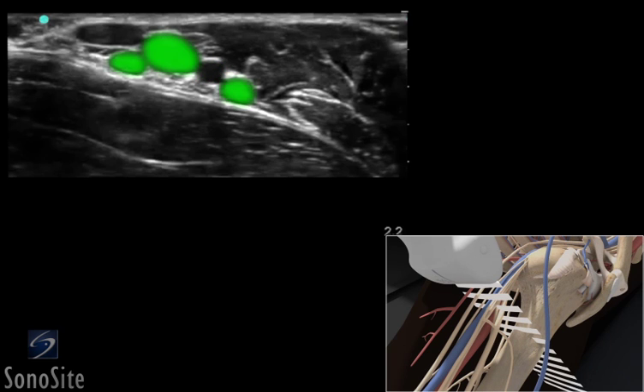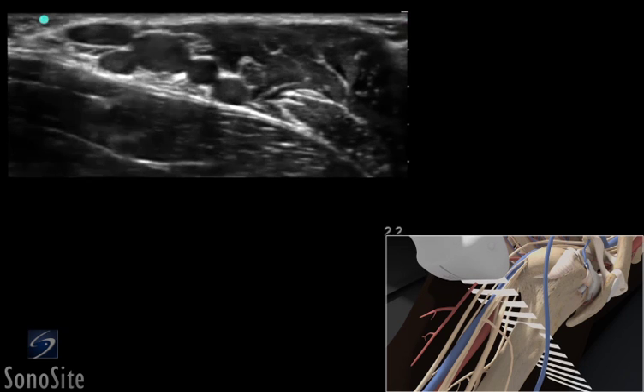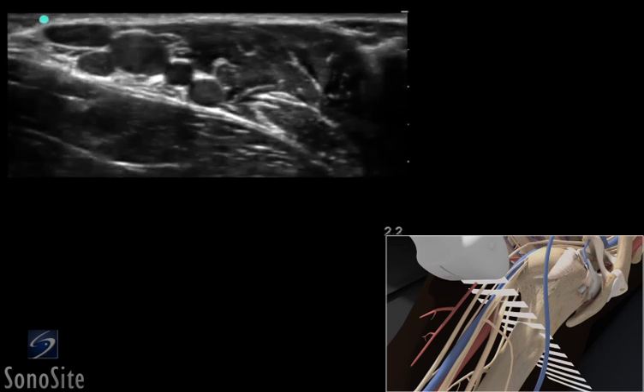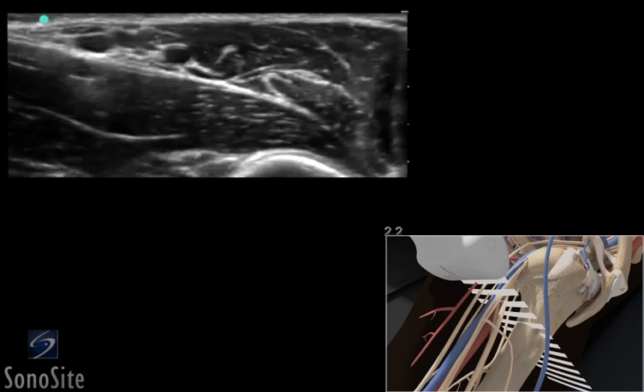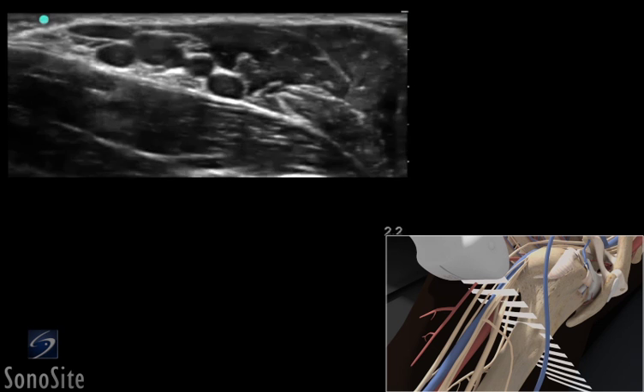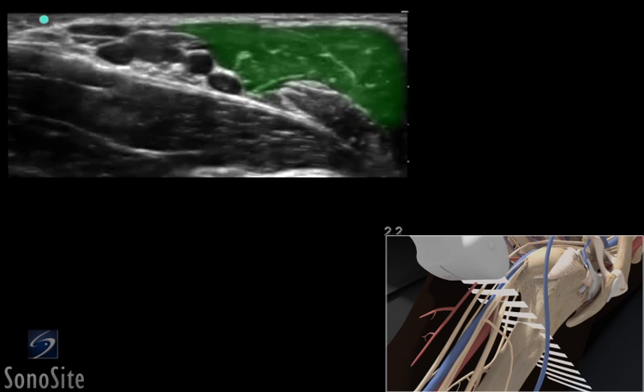The axillary veins lie around the periphery of the artery and are easily compressed. Slide the transducer up the arm to a proximal position so the teres major muscle, which helps control the distribution of local anesthetic during injection, is posteromedial to the artery and nerves. The biceps and coracobrachialis muscles will appear lateral to the artery.